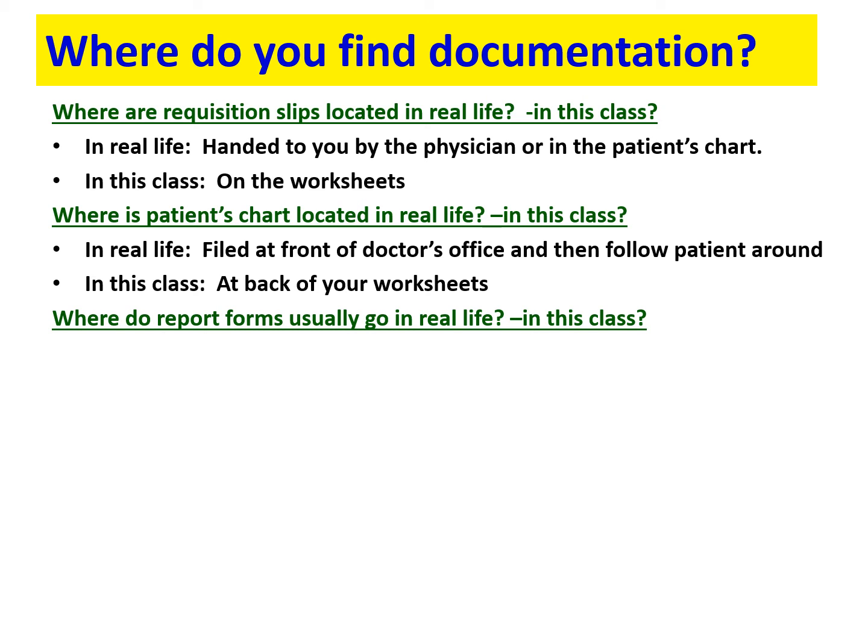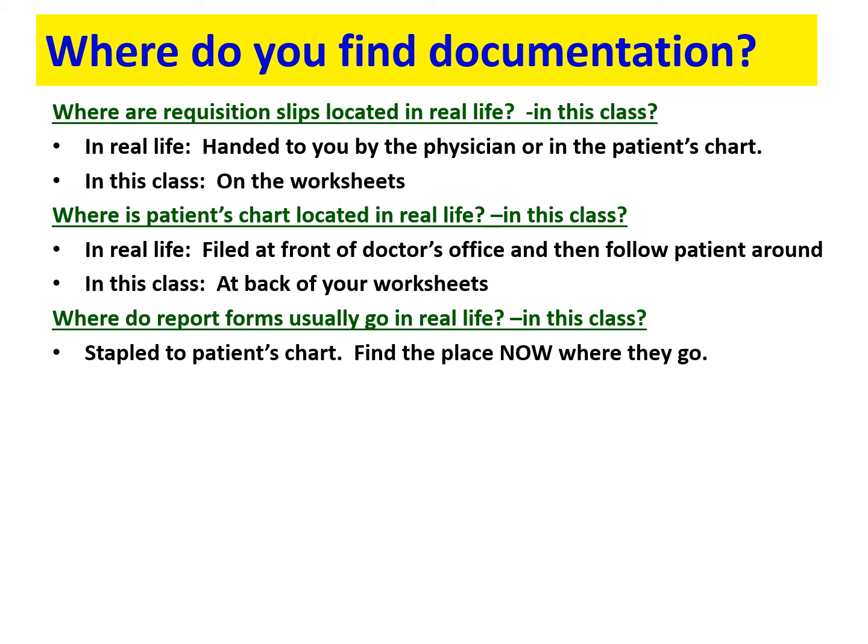Again, talking about report forms in both real life and in our classroom. We understand that a lot of times those report forms are either stapled to the patient's chart, or they can be electronically uploaded to the laboratory section of that particular patient's chart in their electronic medical record, okay?